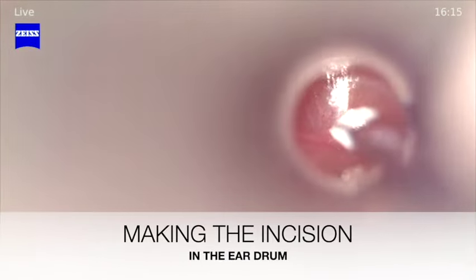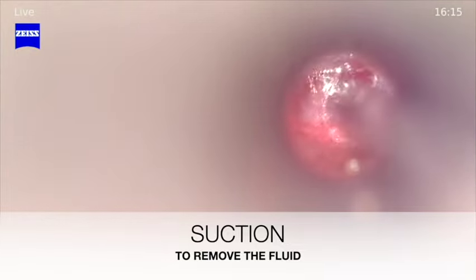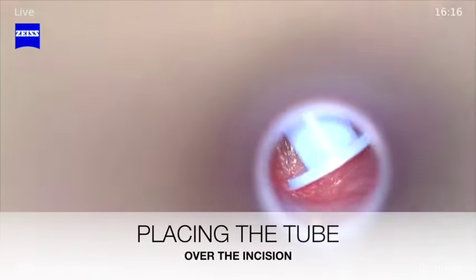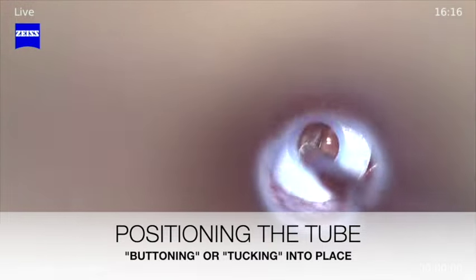Here, a small knife is being used to make an incision in the eardrum. A suction is then used to remove fluid from behind the eardrum. A tube is then placed over the opening and buttoned or tucked into position using a pick.